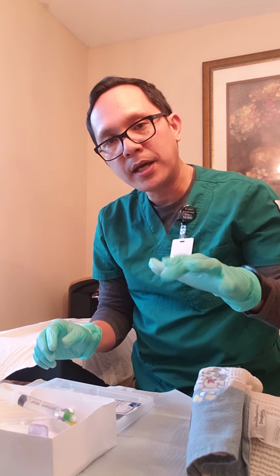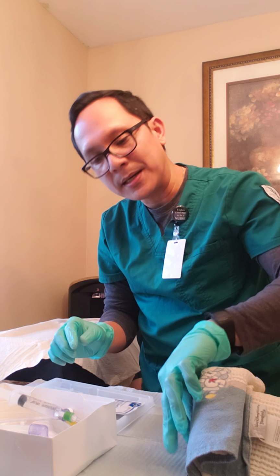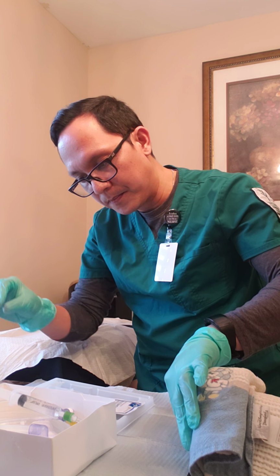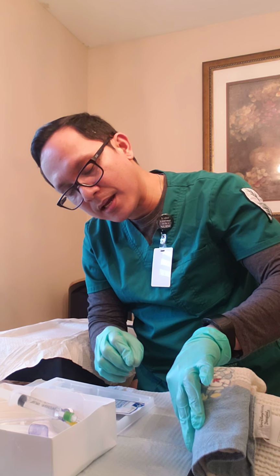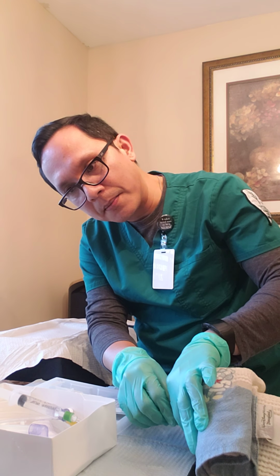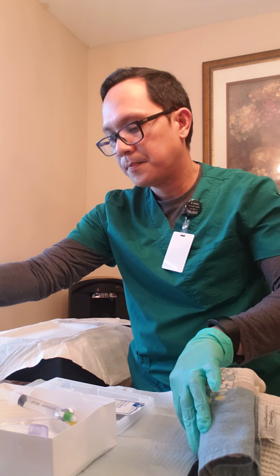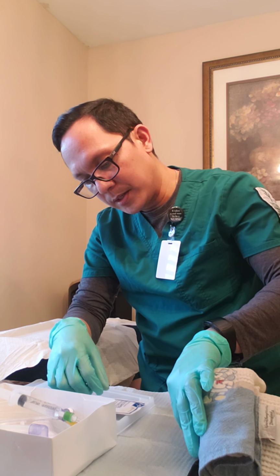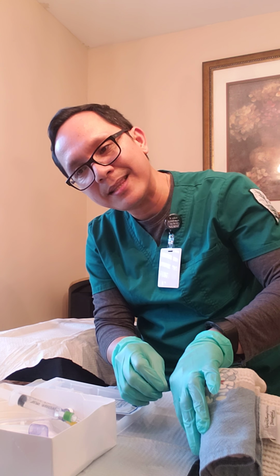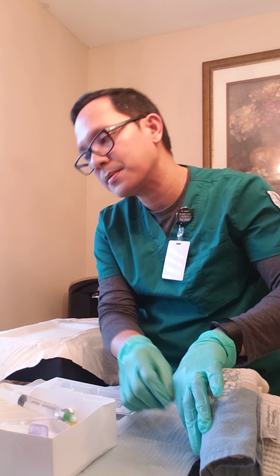The insertion. Okay, once we're ready, I'm going to go ahead with my non-dominant hand, open the labia minora of my patient, exposing the meatus. I'm going to clean that area, starting on the labial folds first, from up going down to the anus. And the next one, with another betadine swab stick, I'm going to clean the center area from the clitoris down to the anus, downwards.